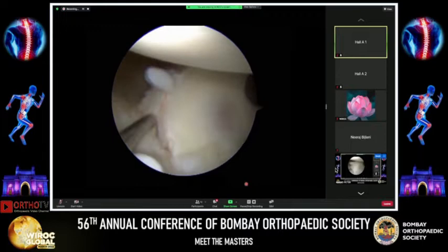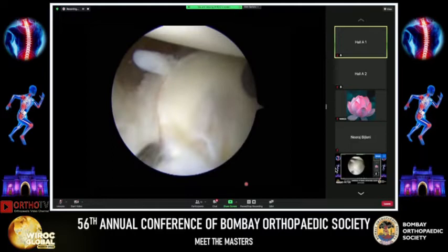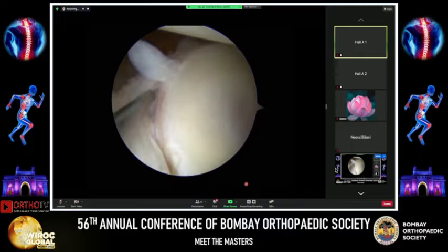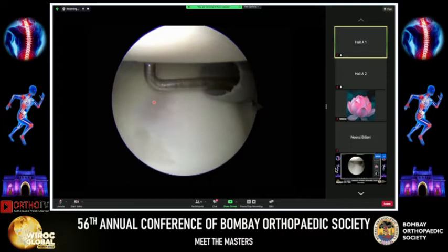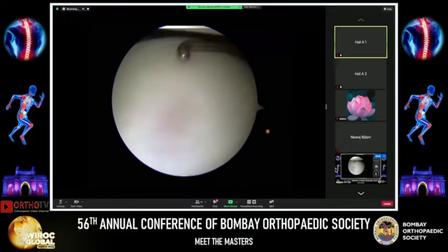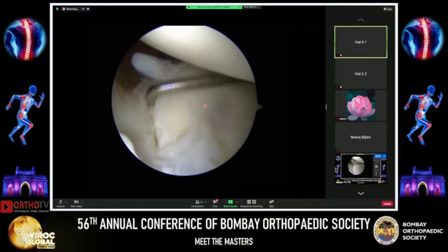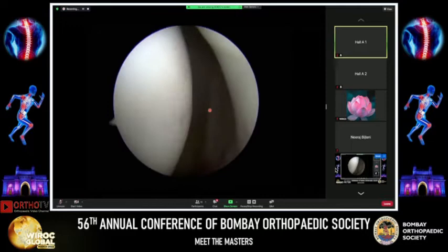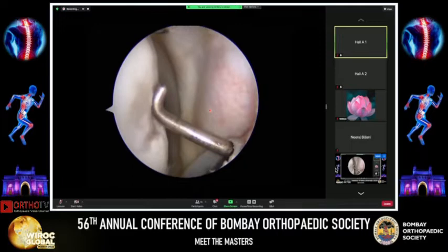Visualizing from the anterosuperior portal, I have a good bird's eye view of the entire glenoid and labrum. I use the probe to diagnose and assess the extent of the tear — that's the Bankart lesion, the anterior inferior labral-ligamentous avulsion. That's the anterior band of the glenohumeral ligament. Using the probe from the posterior portal, I assess glenoid bone loss — there's no significant loss. Looking for the Hill-Sachs lesion, it is very shallow and not deep enough to warrant a remplissage.